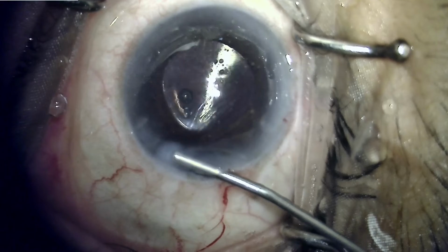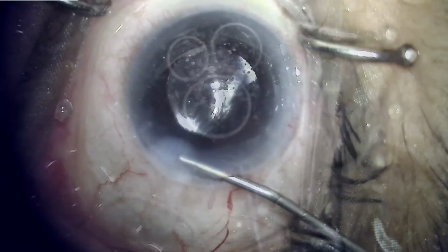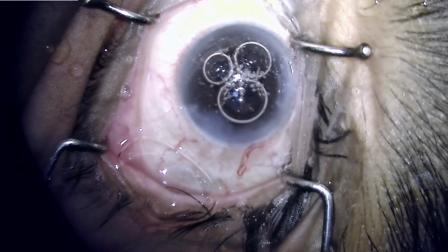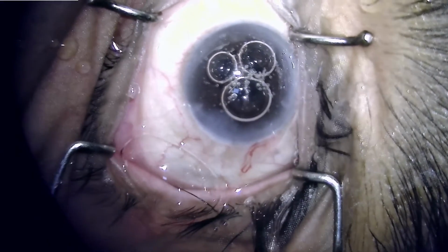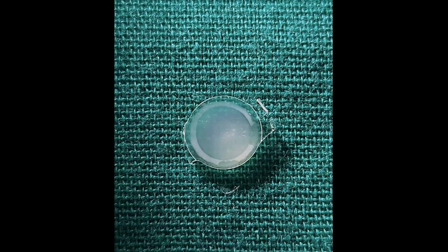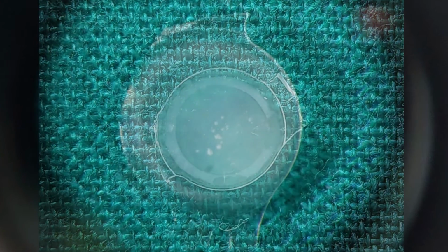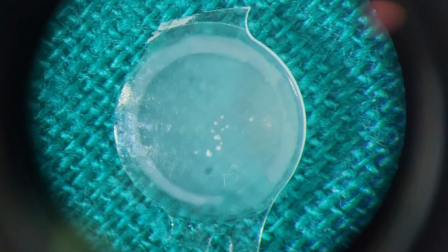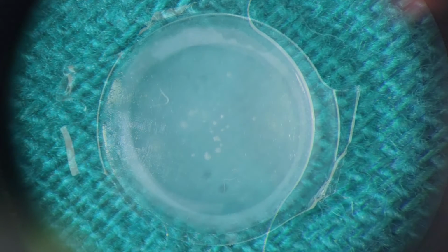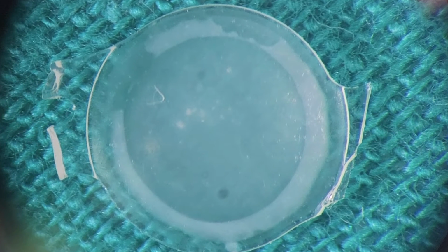The wounds were hydrated, and now we have 3 wounds here, 1 side port and 2 main incisions. An air bubble was kept in place just to inflate the anterior chamber, and the surgery was accomplished. This is the explanted IOL, which we can see has a lot of calcification in the central optic part and part of the peripheral zone. These are some YAG laser pittings which are seen, and this is the other side of the IOL where we can see the anterior surface.